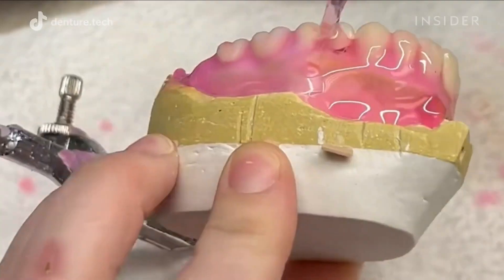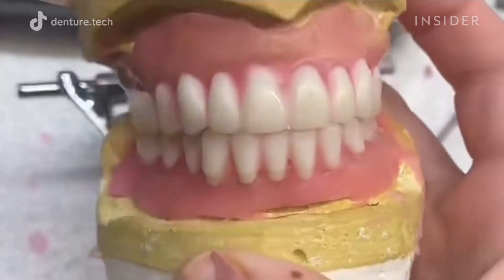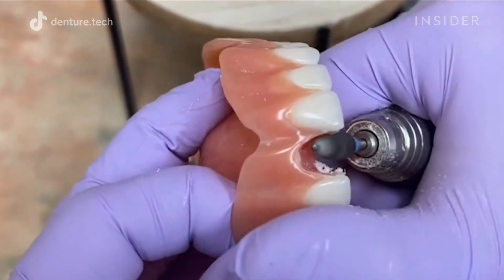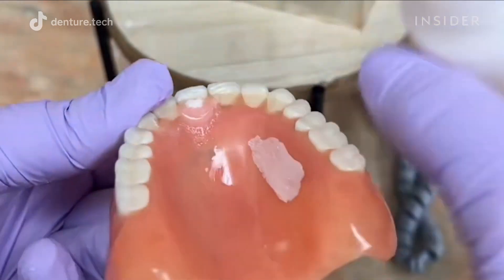This is how fake teeth are made. Fake teeth, also known as dentures, are realistic replacements for missing natural teeth. They fit snugly over the gums to be used in place of a single tooth or all of your teeth.